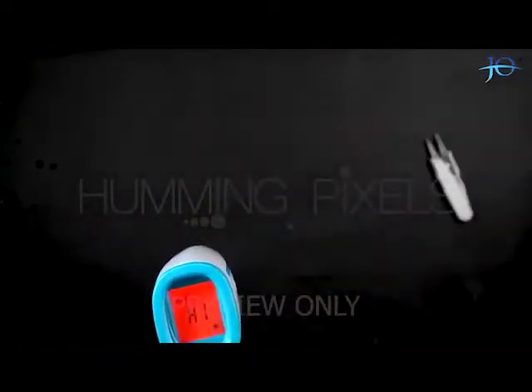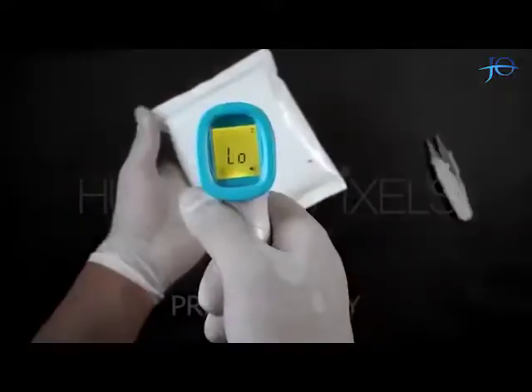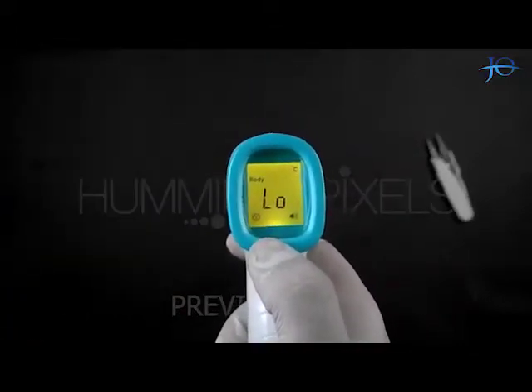Now we will again use the ice pack and see how the temperature gun reacts to low temperature. It is now showing a yellow light along with the temperature warning: Low.